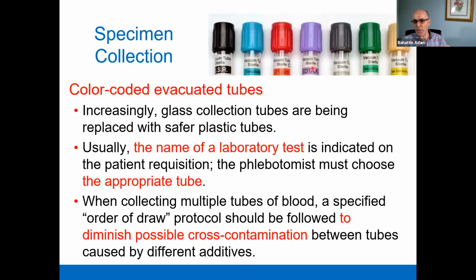Each tube has different anticoagulants and additives, and the purpose of each tube is different based on the test requested, and therefore you have to choose the appropriate test tubes.